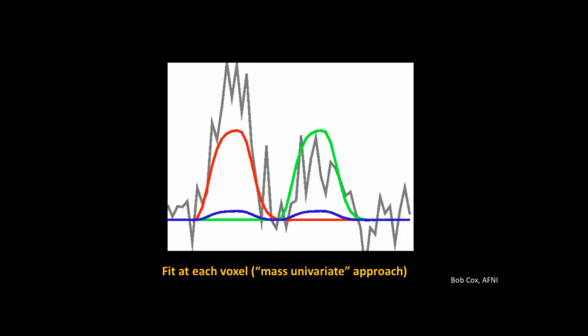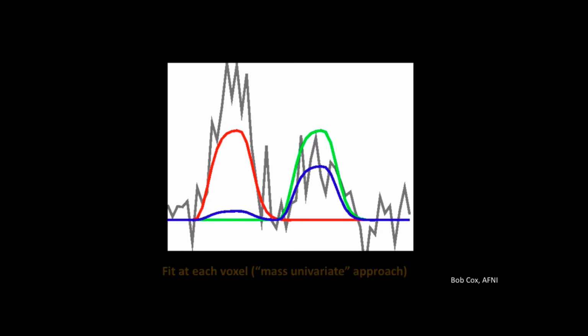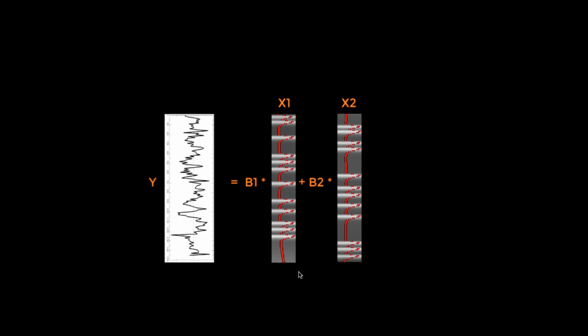Like, how do you assign the value at any time point? If you go back to that slide, like the data matrix. This one right here? Yeah, I think this one.